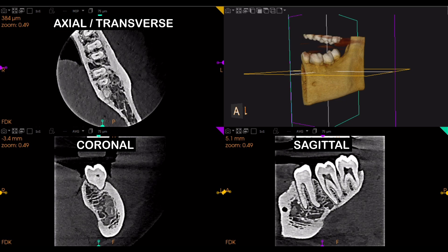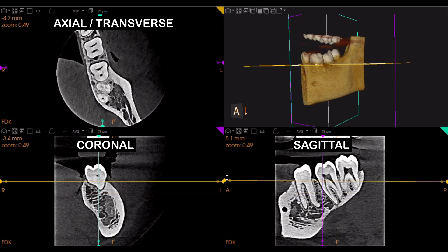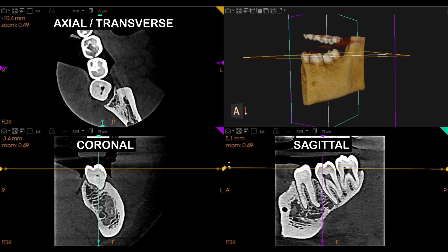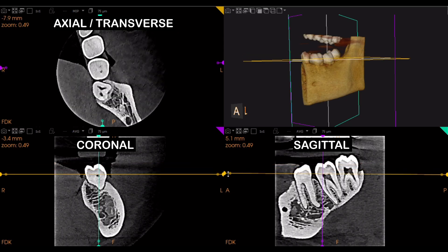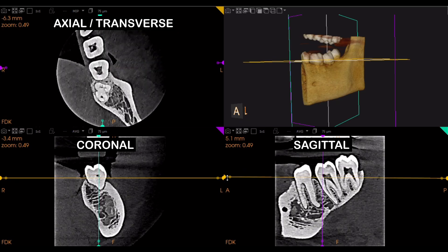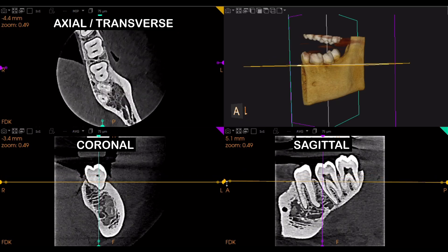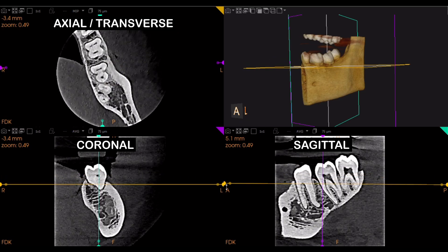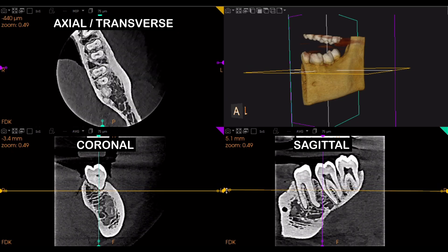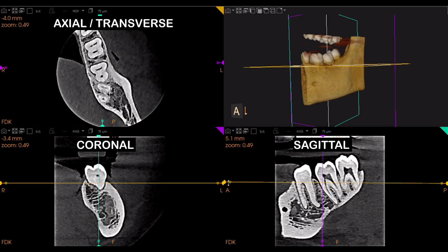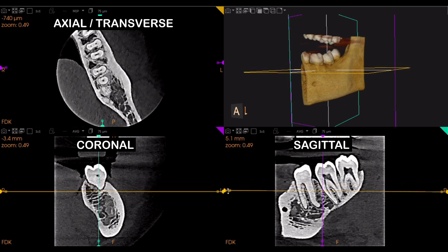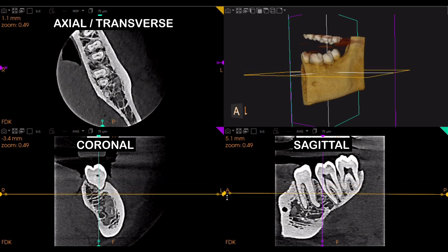As we go up and down, you can see the internal anatomy of the structure in the axial section — the roots, the bone, the cortical plate. Here you can see the crown part; as we go down we enter the furcation area and you can see the two roots have separated. Going further down you can see the different root canals of those particular teeth as well. All these things are visible in the axial section.